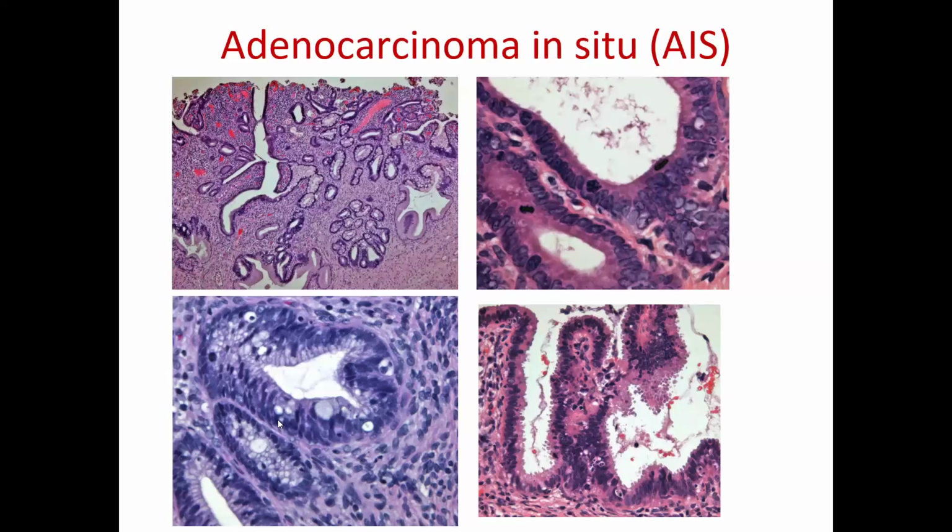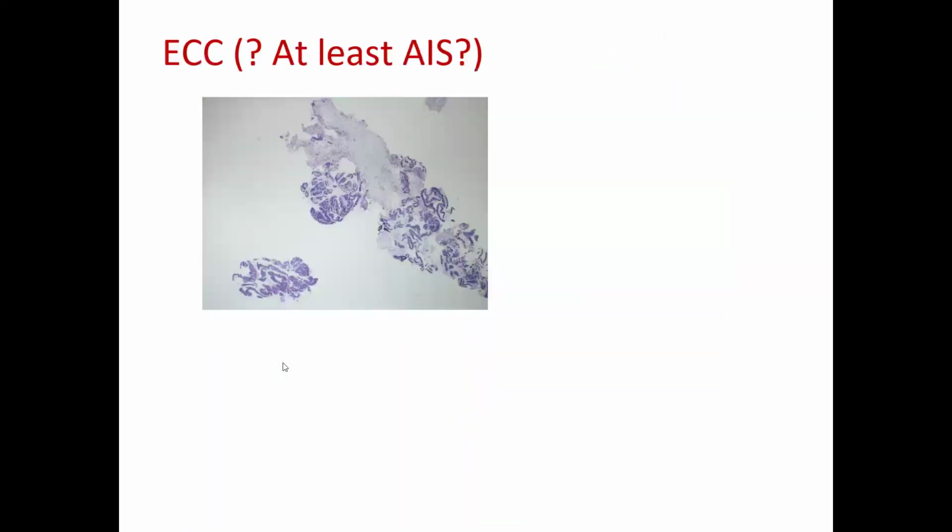Before I leave this field here, let me ask you this. What do you have to say about the complexion of these nuclei? How do they look to you? How does the chromatin look? Is it dark and smudged, or do you see nuclear details and chromatin details? I hope you can see that they are smudged and blue. It's almost like ink. They are done by ink. And that is the feature of HPV involvement.